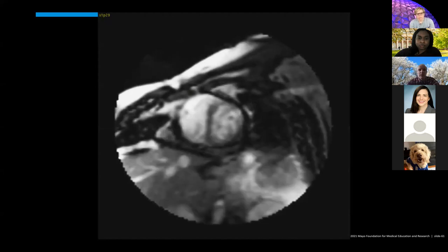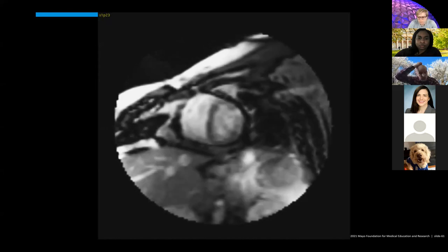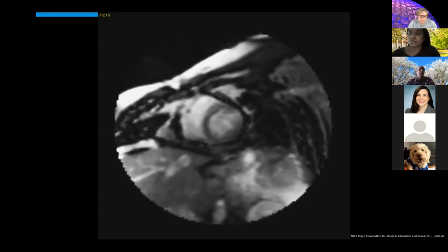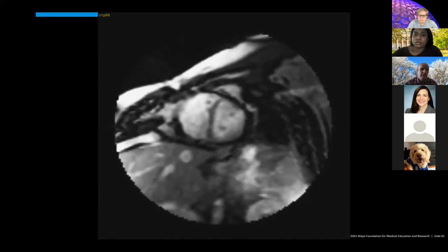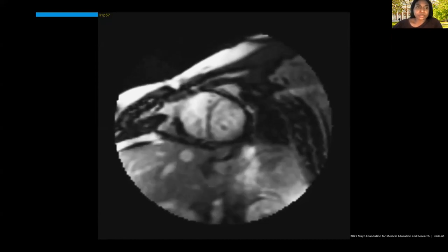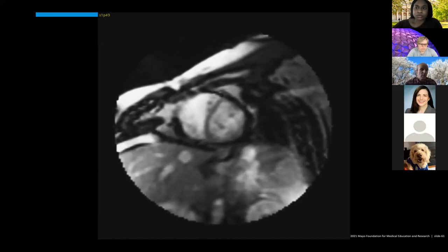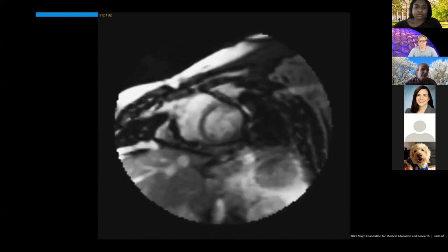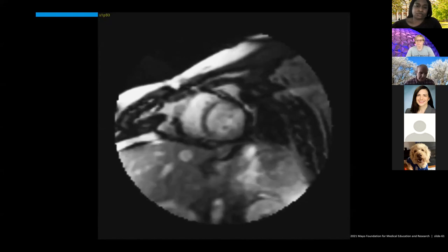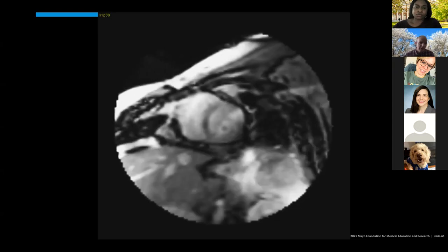And one of the ways we diagnose this clinically is to do real-time cardiac MR. And that's what you're seeing here in this movie. These images were obtained in real time, and then we instruct the patient to take in a deep breath or perform a Valsalva maneuver that increases systemic venous return. When you increase systemic venous return, you get more blood coming into the right atrium and right ventricle.